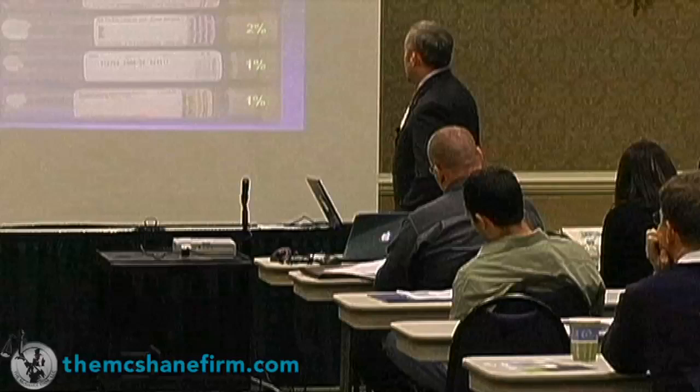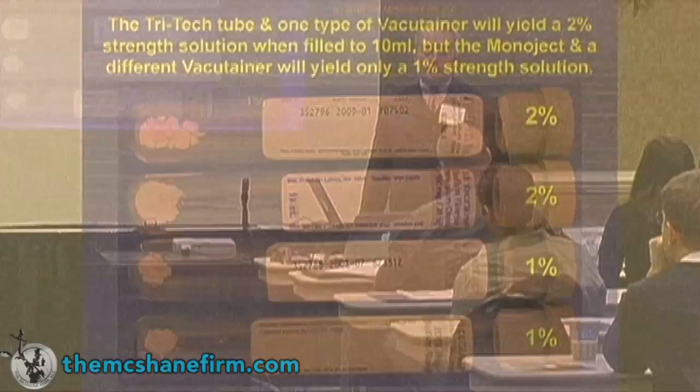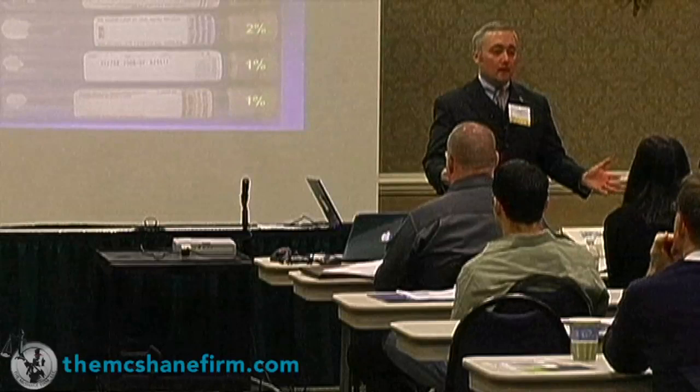It's important to know how much sodium fluoride is there, for a magic word that we're going to come back to, and I'm going to mention at least three times in my limited time that I have left with you folks, called Candida albicans. Candida albicans is a yeast. It's omnipresent. It's all over our skins. Not to gross you out, it's everywhere. You just can't get away from it.